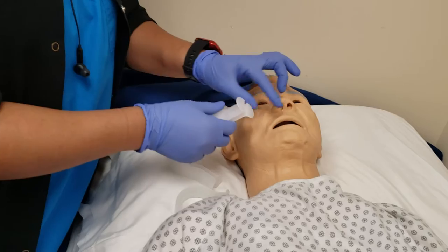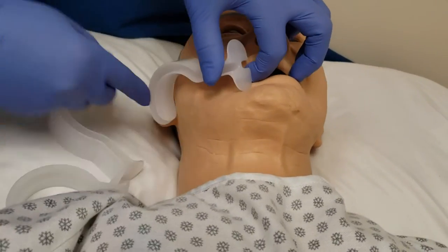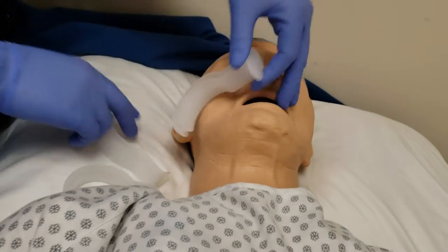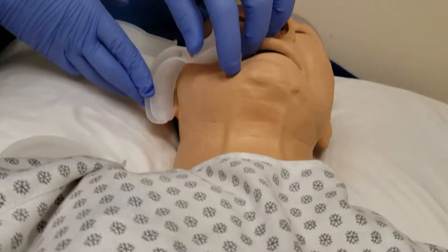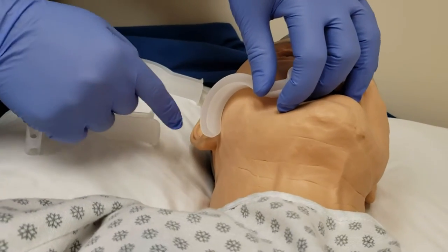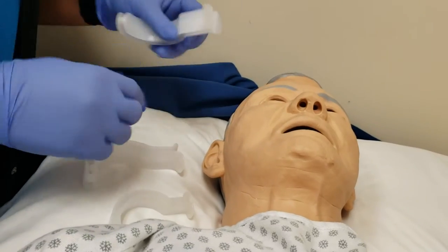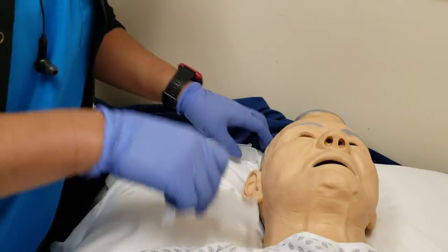The way we're going to measure this is from the tip of the mouth to the ear. This one's about right. This one will be too big — you'll see it'll go past the ear. This one will be too small and it won't reach the ear. Because I tested this earlier, this patient is not going to be able to take the proper size because this mannequin's airway is kind of small.